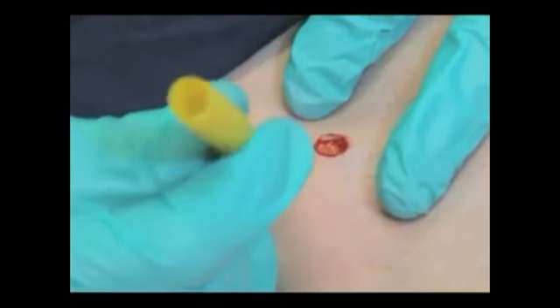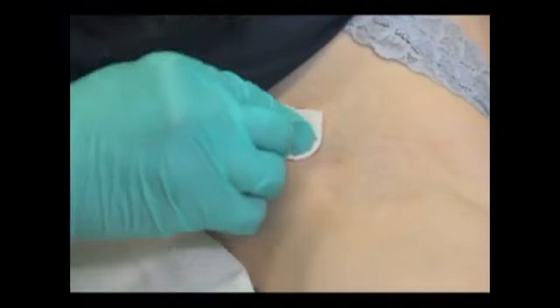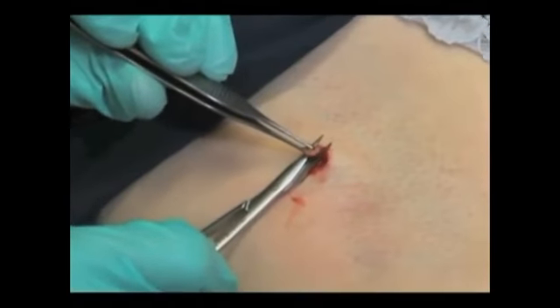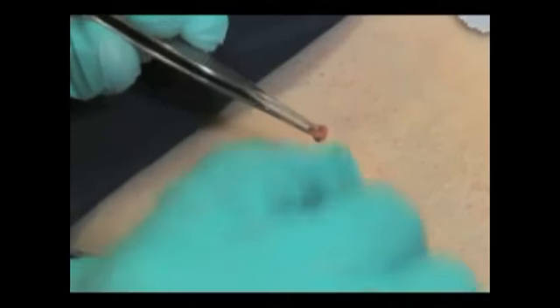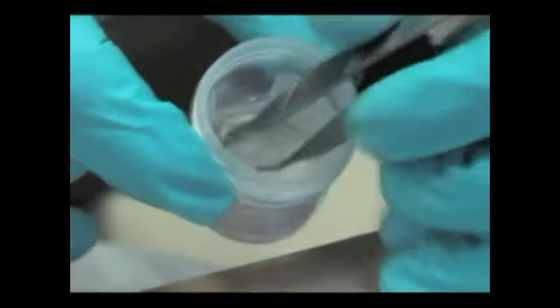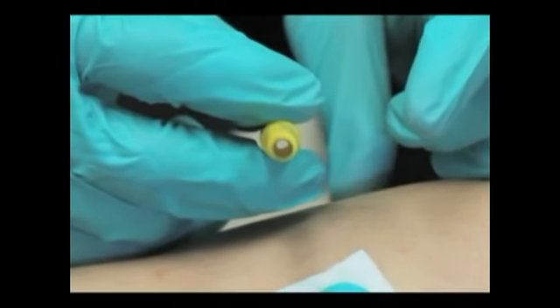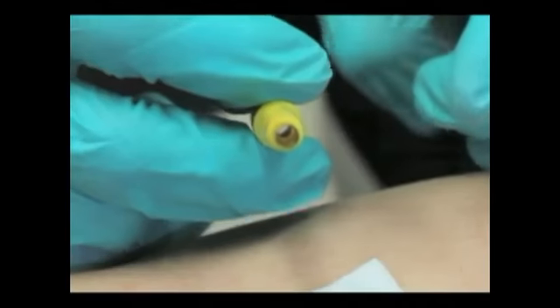Withdraw the punch. At this point, bleeding may occur and require blotting with gauze. With toothed forceps, carefully grasp and lift the specimen, taking special care not to crush it. Use scissors to cut out the base of the specimen at the level of the fat. Place the specimen in a labeled bottle that contains the appropriate reagent, here, formalin. Check the punch instrument to be sure no tissue remains there. A good rule of thumb is to be able to see through the entire hollow tube.